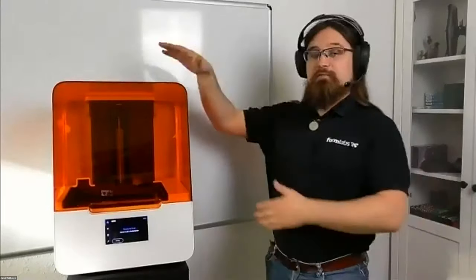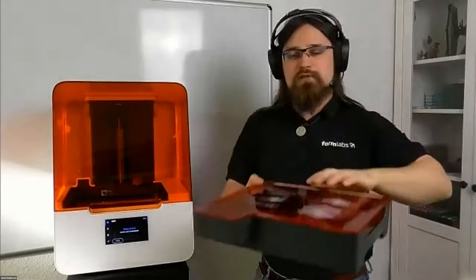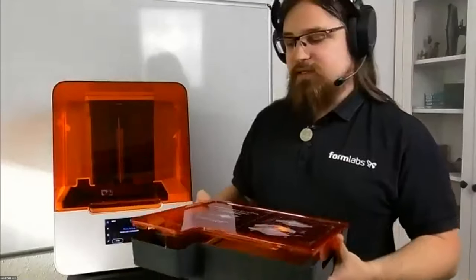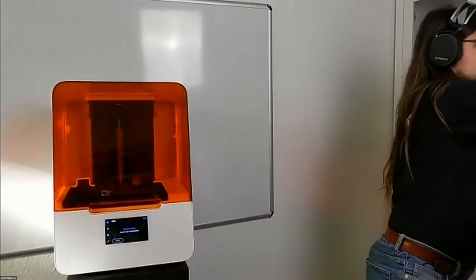Yeah, I just wanted to very quickly show you how easy it is to actually set up the machine. And then we're going to go through the printing process itself really quickly. So basically, except for the printer itself, there are 3 main things that you need. First of which is a resin tank. So that's basically the resin bath that always sits at the bottom. These come in these nice, I call them lunch boxes, nice handy boxes here that you can keep the tanks in.